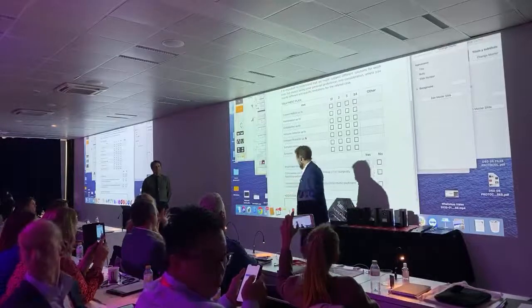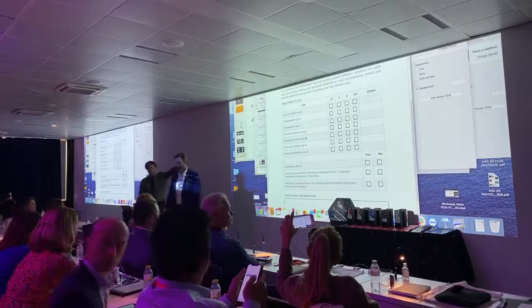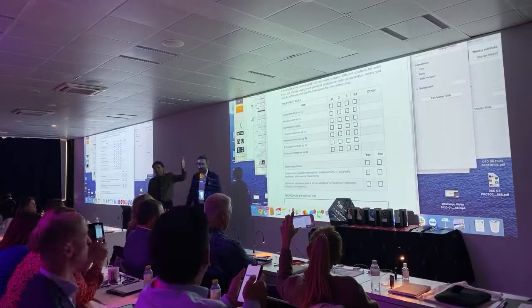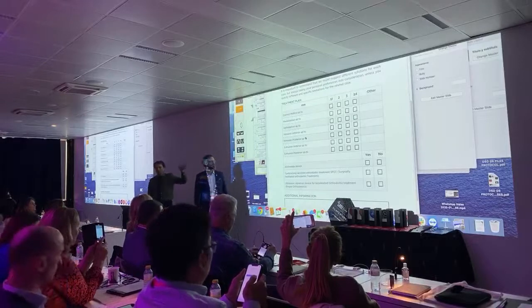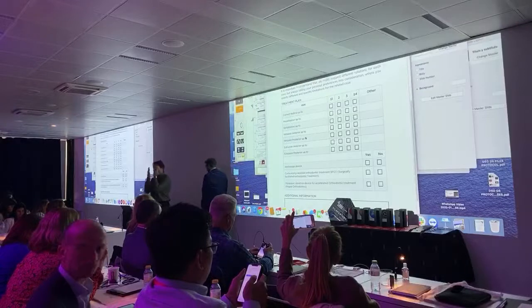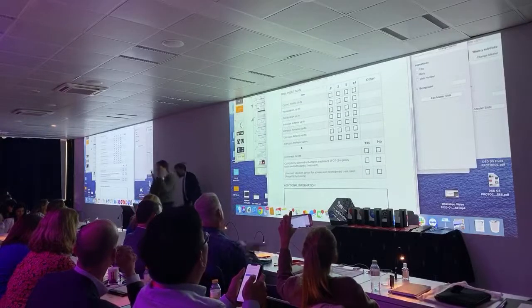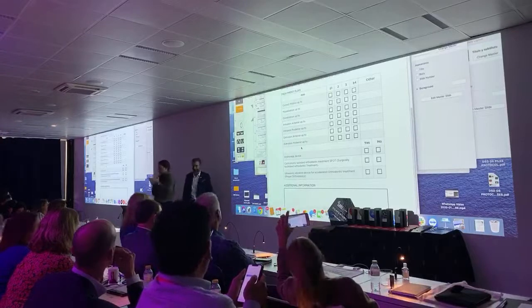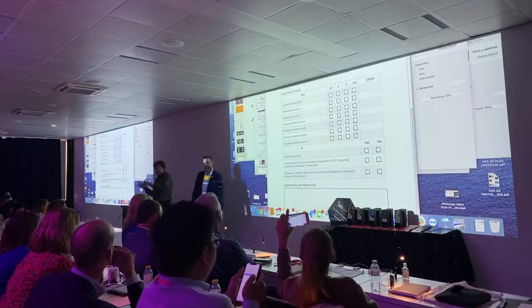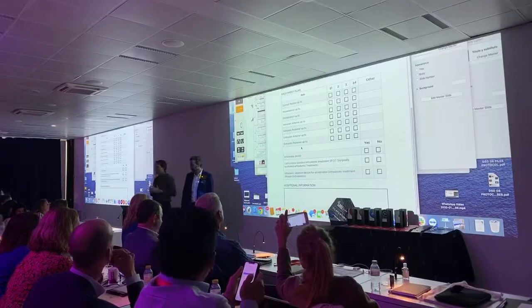We need to do some customizing of the software. These are things that you need to really think about. This questionnaire really needs thinking. When you receive the final presentation, there is the PDF. You are saying you have limitations, and it's not specifically for one case. When you go to an Invisalign case, moving body movement of the two centrals and the full arch more than 3 millimeters makes no sense to me, or I don't have the technique, or I don't have the skills, so don't even go there, right? So it's just to give some parameters.